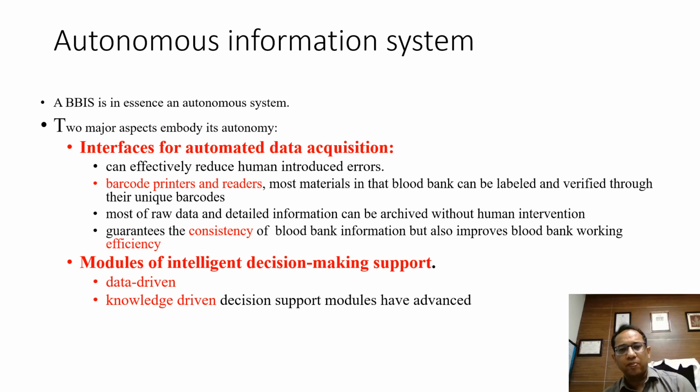So you have the barcodes, you have the printers, the readers, all this material in the blood bank can be labeled and verified through these unique barcodes, and the raw data and detailed information can be archived without human intervention. And this guarantees the consistency of blood bank information, but also improves blood bank working efficiency.